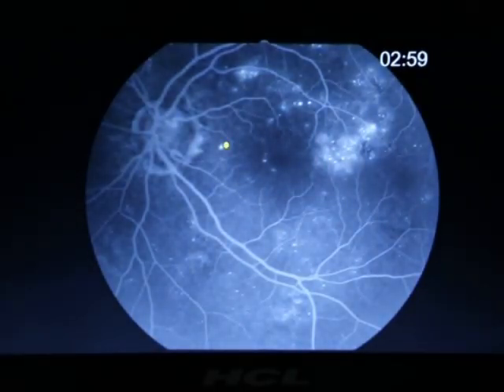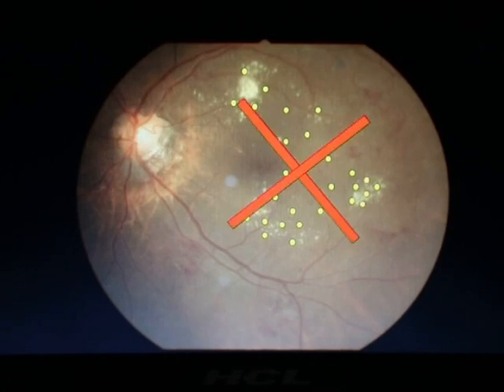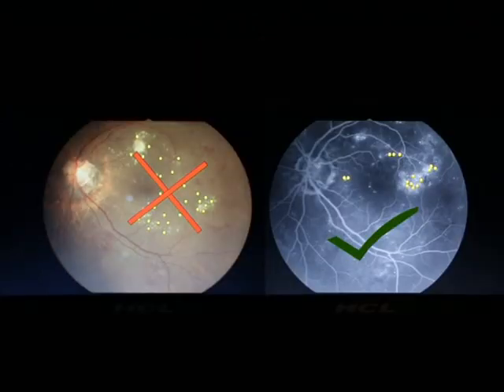In patients with diabetic macular edema or the CSME, the angiogram should guide laser treatment to the leaking lesions. If treatment is based on the color fundus photograph, it may result in indiscriminate laser treatment to the delicate macula, causing needless damage to the photoreceptors.